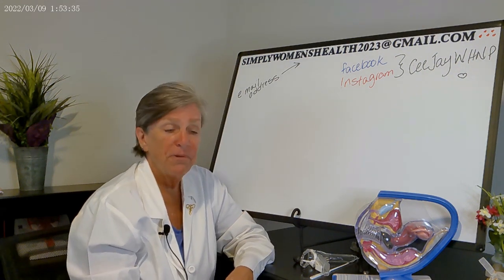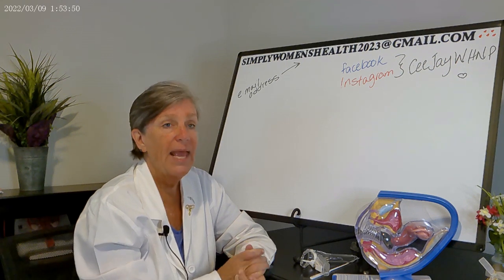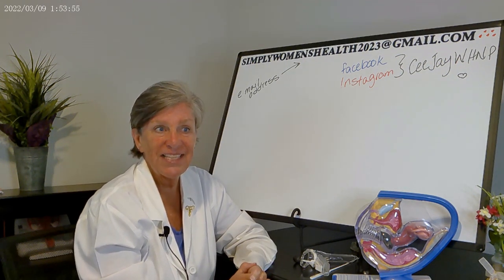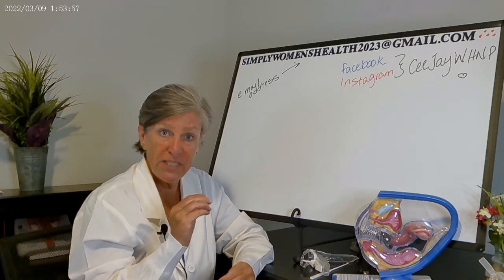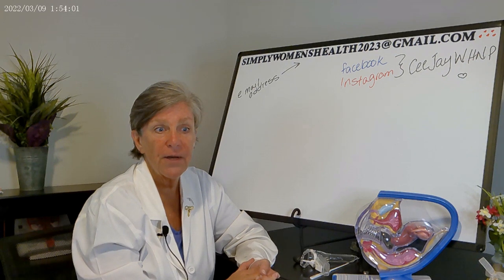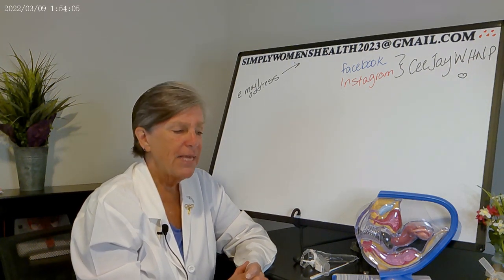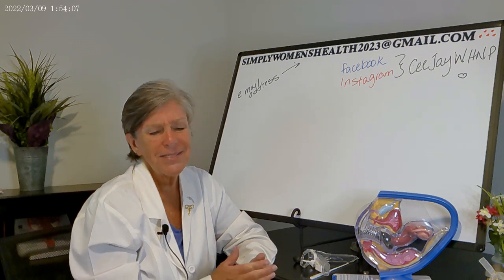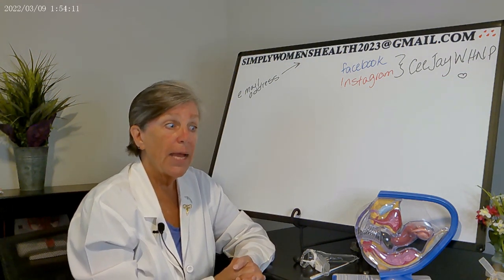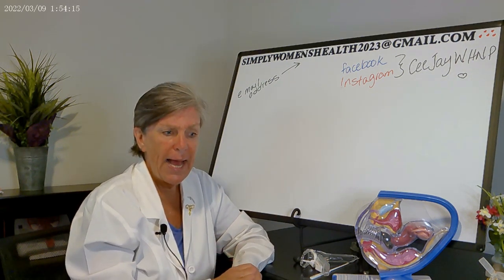As I mentioned before, there are risks associated with this procedure. After the procedure, I usually ask my patients to not put anything into their vagina for the next 7 days. I want those IUD strings to soften up. They typically wrap around your cervix. You don't even know that they're there. After you and your partner resume intercourse, if he says that he can feel the strings, I usually tell my patients, frankly, I don't care if he can feel the strings. I do care if he feels something hard hitting him during intercourse.